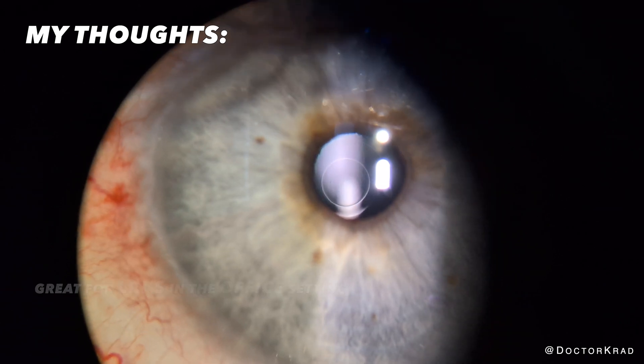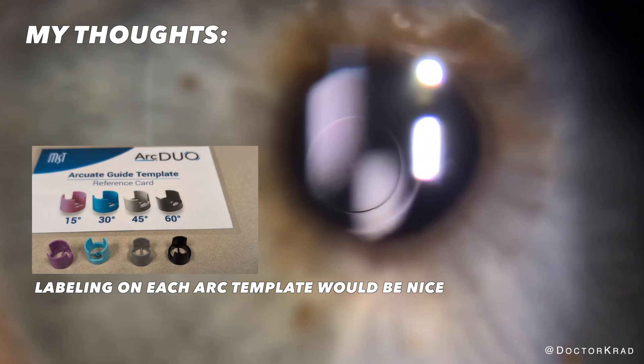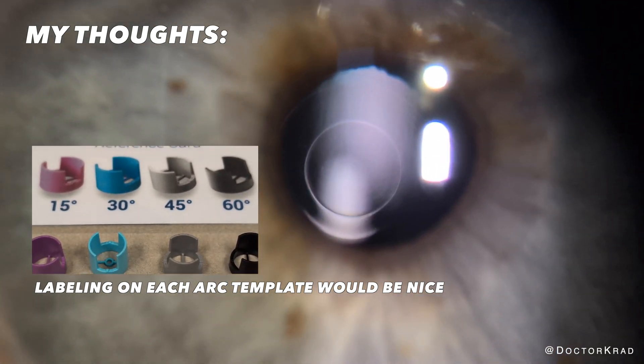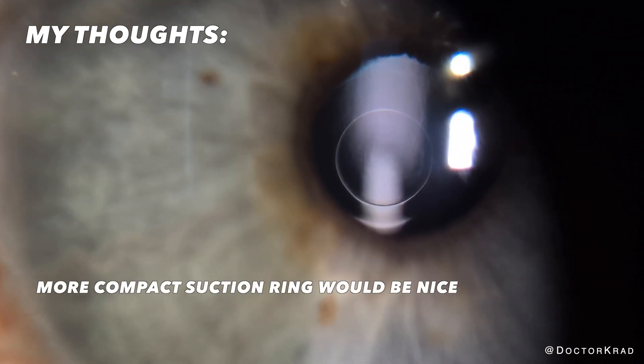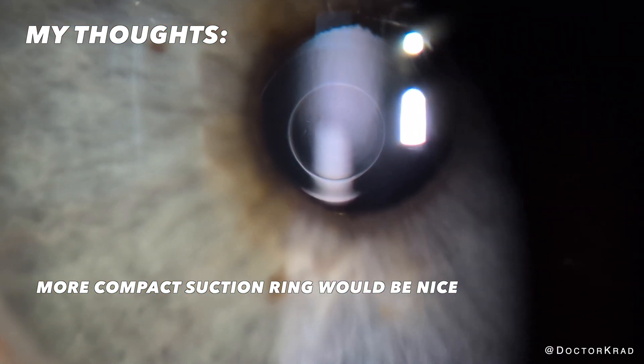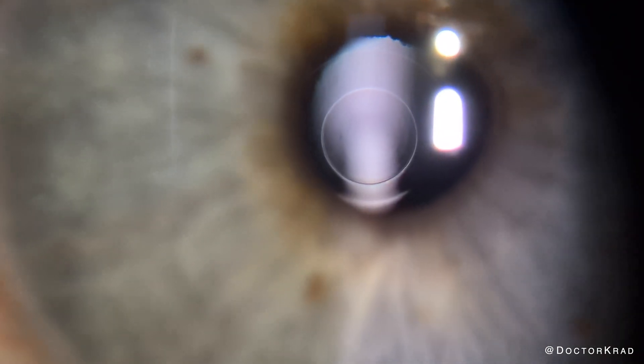Things I would love to see: I would love to see it written on each arcuate template how many degrees are being treated. But until then, you have to use the reference sheet. Also, I wish the suction ring was a bit more compact to fit in smaller, tighter eyes. I hope you found this video helpful. Thank you so much for watching. I'll catch you on the next one. Peace.